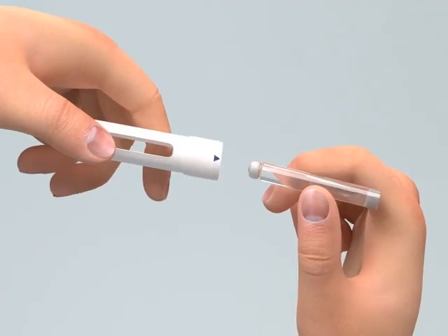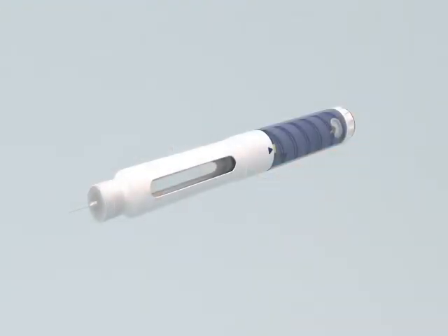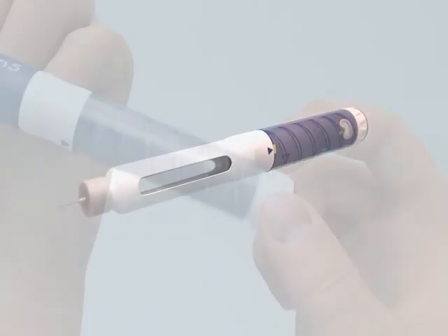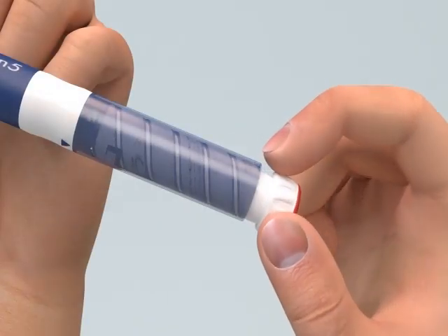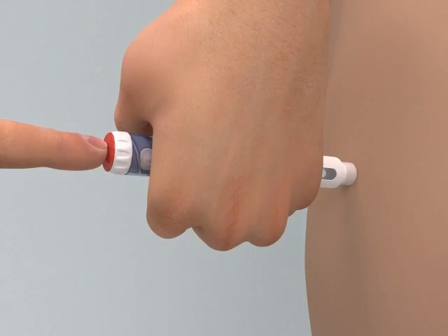It is important to make sure that the pen needle unit is not attached to the pen when replacing your cartridge. Once the pen has been primed for injection, you can set the dose to the number that you noted when the injection stopped and finish your injection.